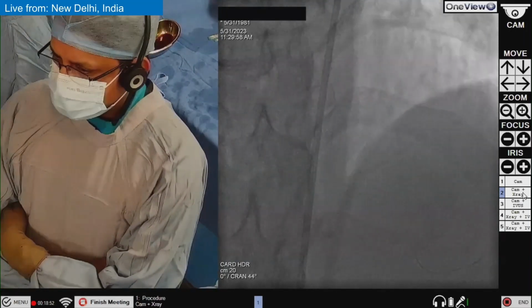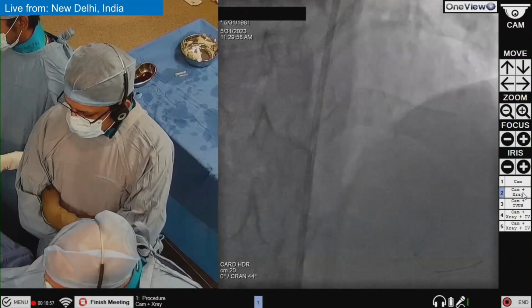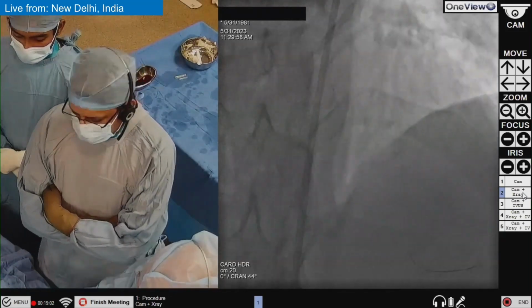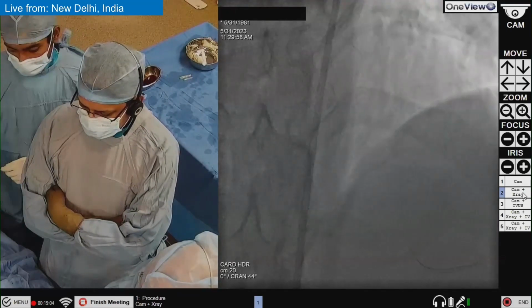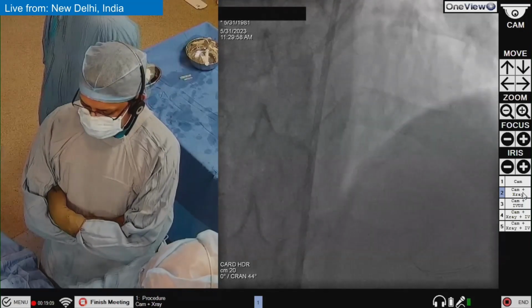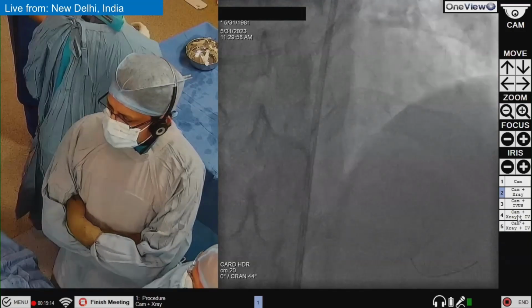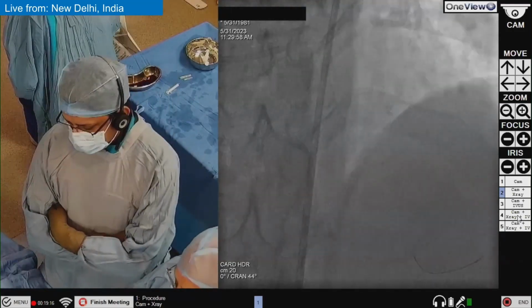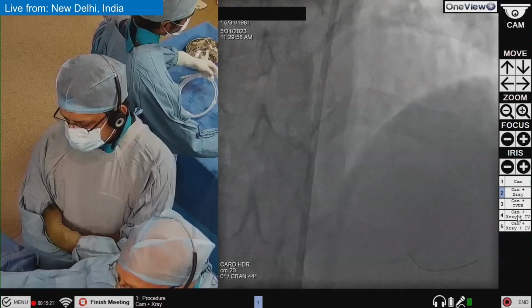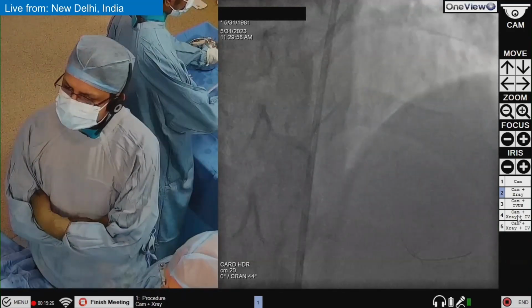And he's planned for an angioplasty to LAD and RCA. And Dr. Rai is planning for a no contrast, or you can say very low contrast angioplasty to save his kidneys. So right now his creatinine has improved to 1.4, but he has a tendency for this rise in creatinine. So we are overcautious in giving dye. So we are planning that we'll go by the previous angiography only and will not use dye as much as possible. And if we require, we'll use a diluted contrast, maybe 5 or 10 ml. So we'll go by the angiography.